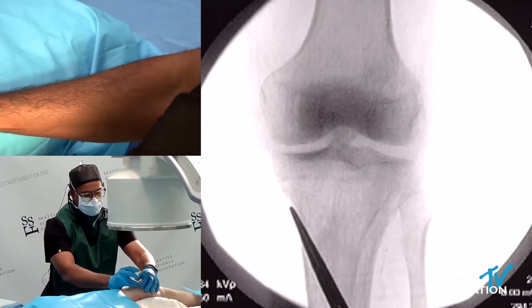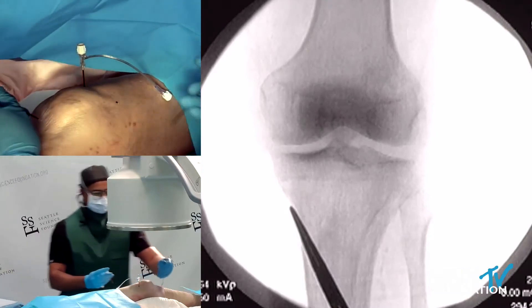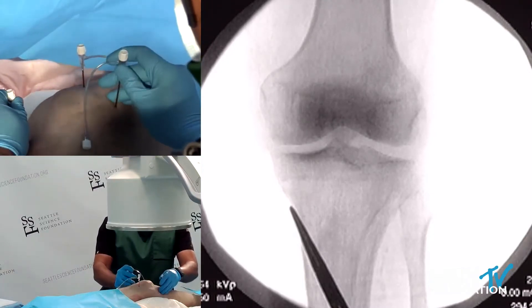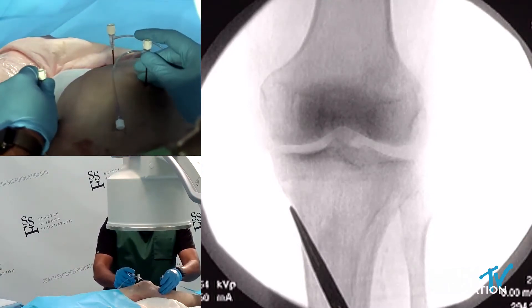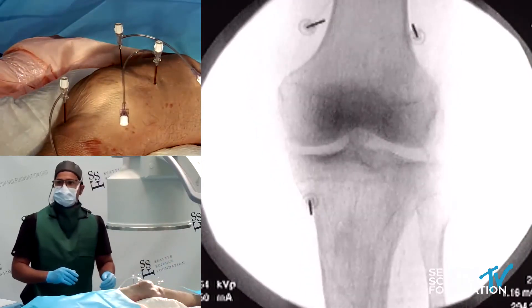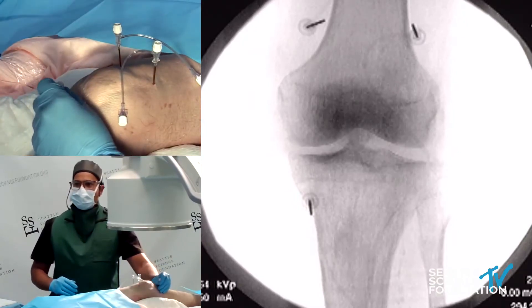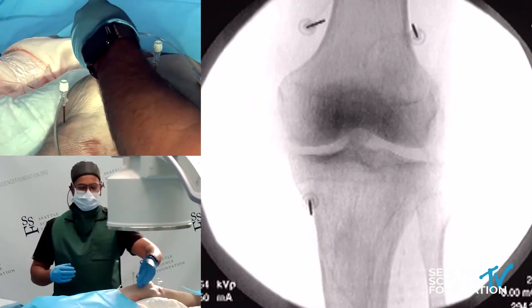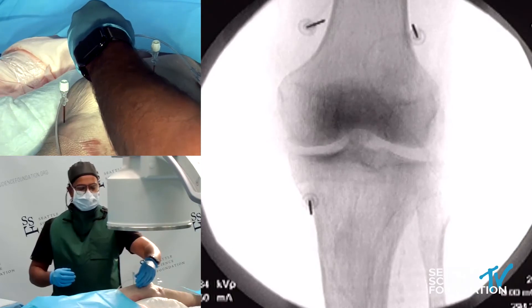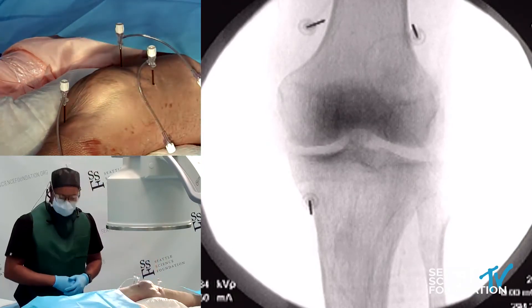To get started here, we're just going to start placing our needles. I certainly like this system because it has pigtails to allow you to inject through without having to take things in and out. I'll put all three in and then make adjustments. You don't need to be right on the bone because, again, you're creating that nice spherical lesion. Everything looks pretty good here — I might advance just a little bit, and then we'll go to a lateral.